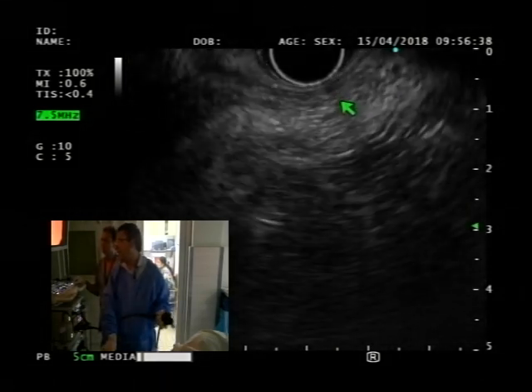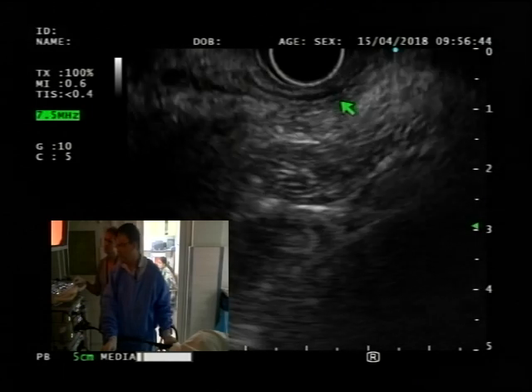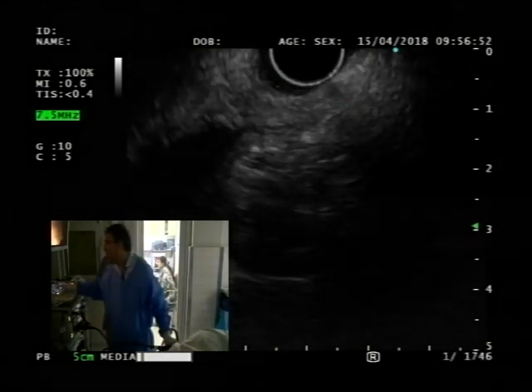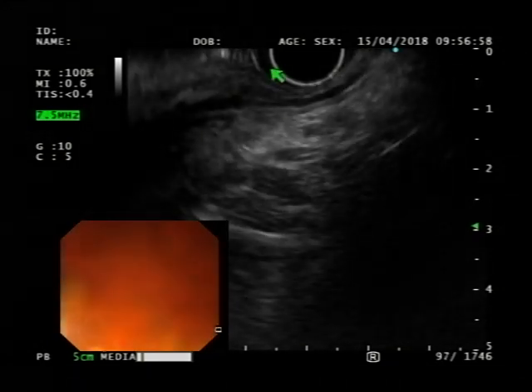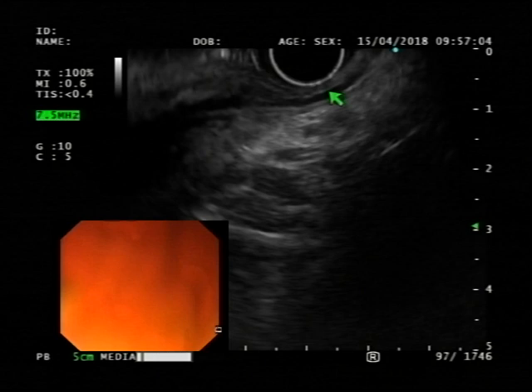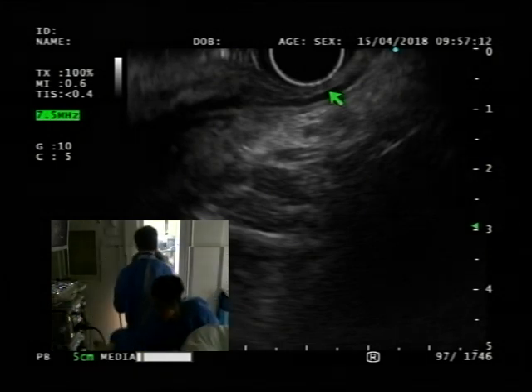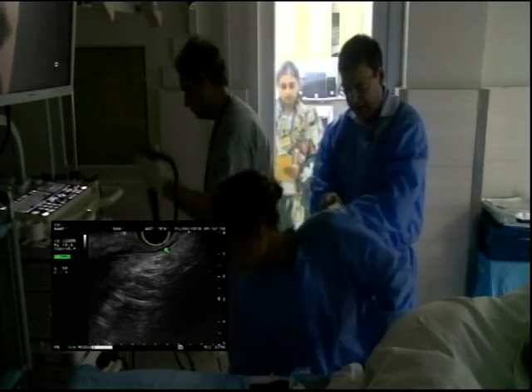So here I will come out a little bit and see if I can. It's really hard to appreciate the sphincter with this, but we'll see. So here, you see that it just came out. I'll go back a little bit. Right there. This is a part of the internal sphincter. You see that? It's very thick. Yeah, we can see. So that's a part of the internal sphincter. I'm already out endoscopically, so let's stop that. So really, we did not see anything major on that. Okay. No lymphadenopathy, slight wall thickening at the area of prior tumor, and no tumor noted.